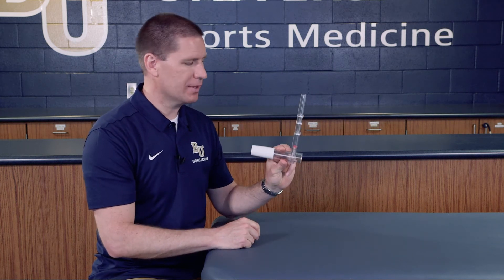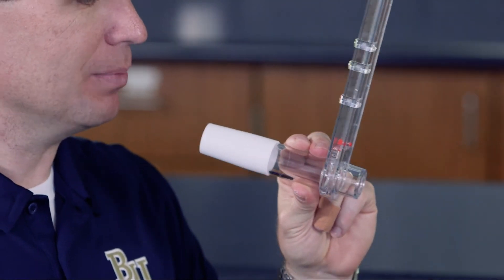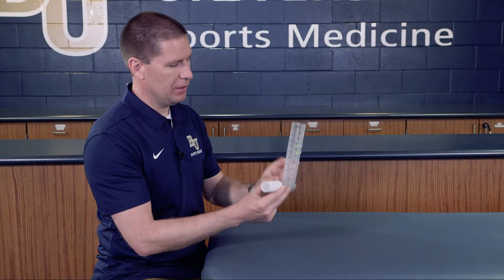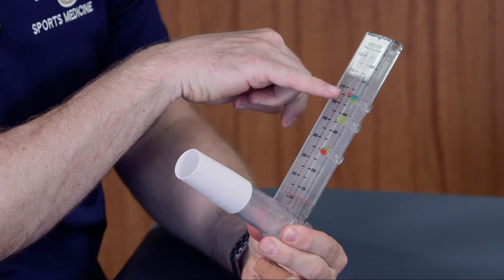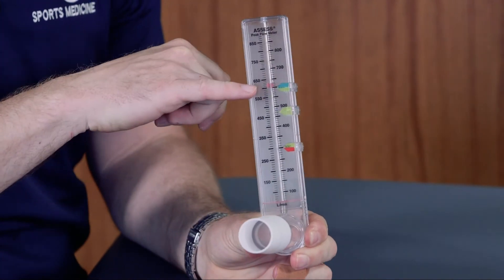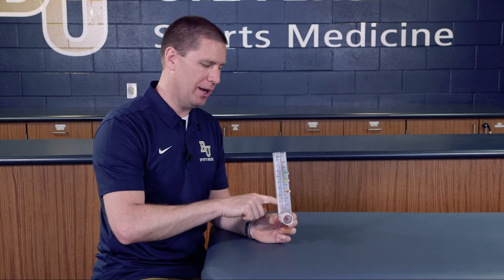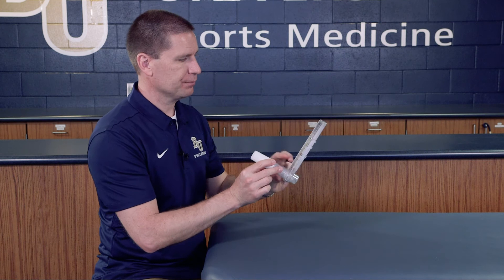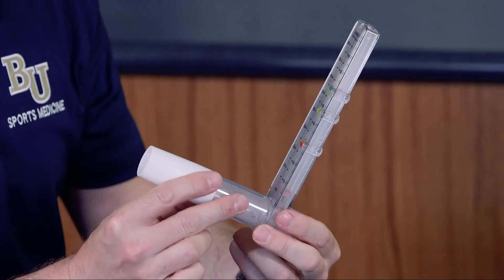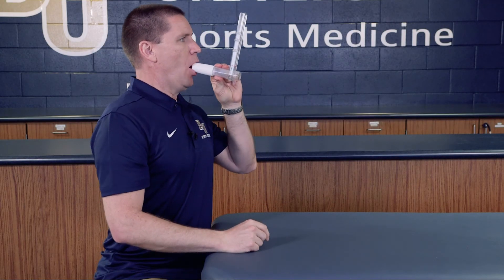Hold it off to the side just like this. I'm going to take a nice deep breath in and blow out as fast and quick as I possibly can. You'll see this raised up — it moved the red line up to about 620 liters per minute. You want to do this more than once. I marked down 620, did it again and got 600, then one more time and got 630.